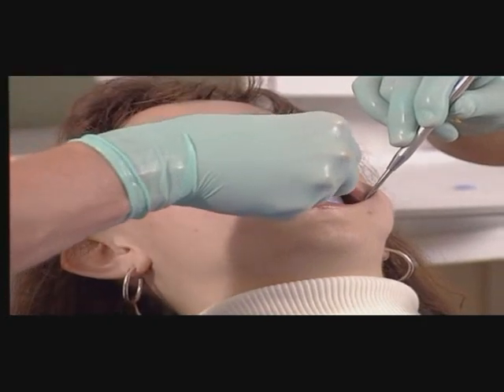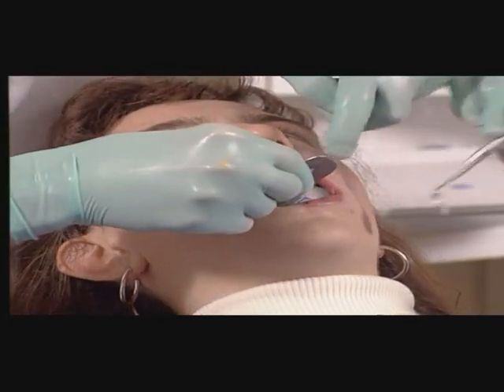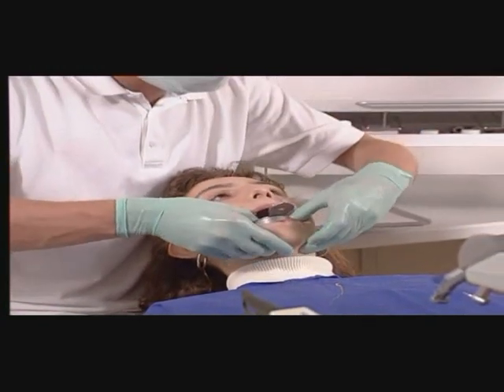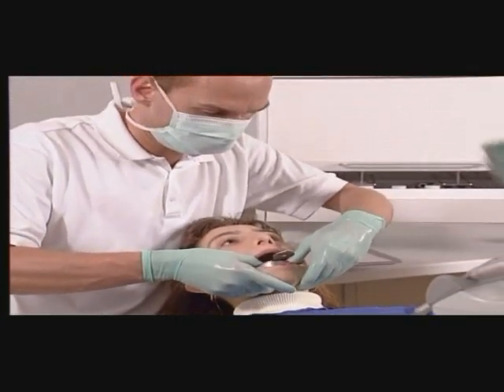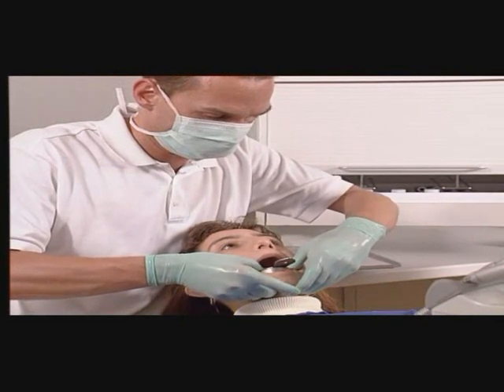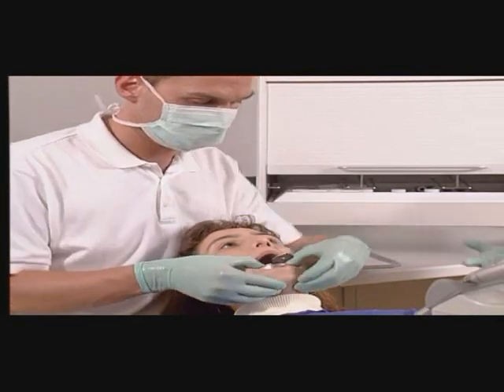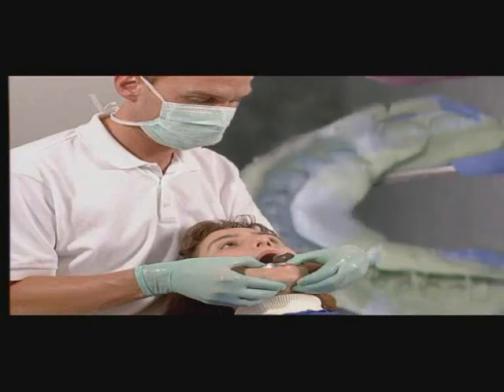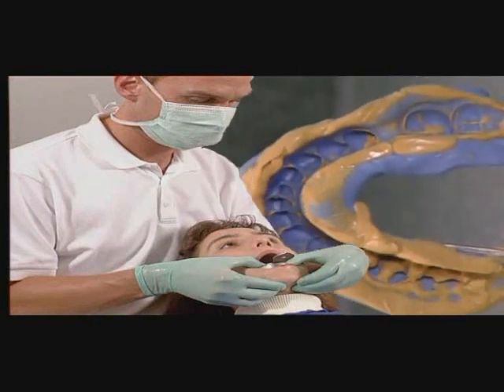Taking a precise impression of the patient's clinical situation is necessary for accurately detailed and dimensionally stable models. The industry offers the widest variety of materials for this. An appropriate impression material can be chosen according to the patient's result and the model's purpose.